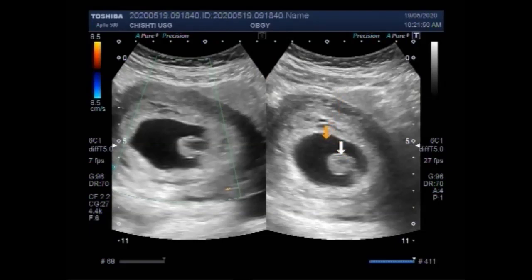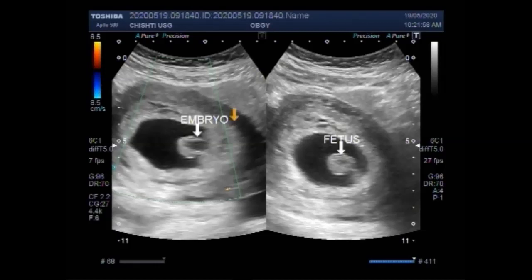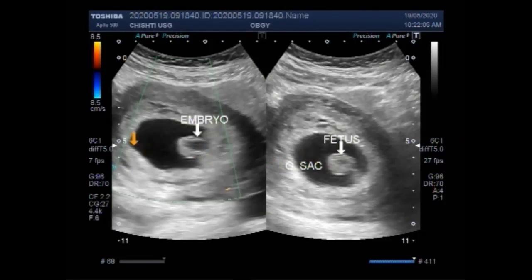This is the fetal pole. This is the gestational sac.